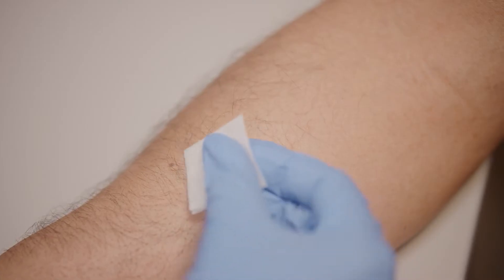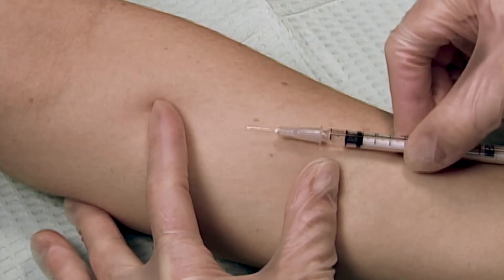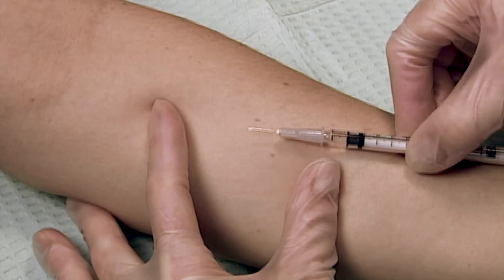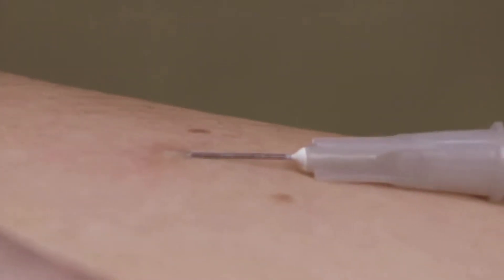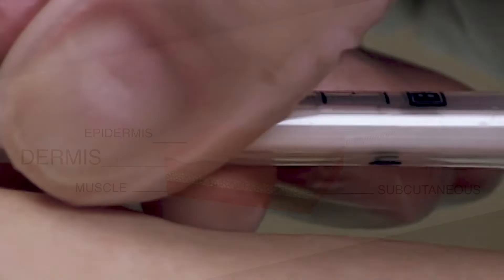First, clean the site on the forearm where you will do the injection. While pulling the skin taut, position the needle with the bevel facing up and insert the needle at a 5 to 15 degree angle into the skin, staying very shallow.